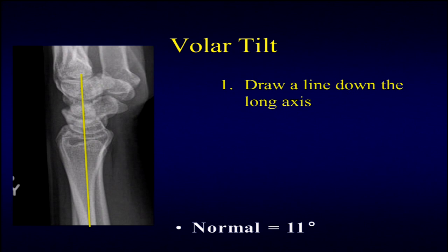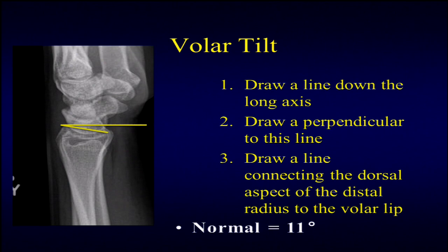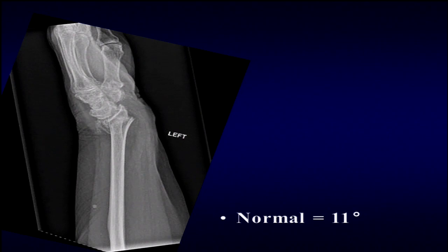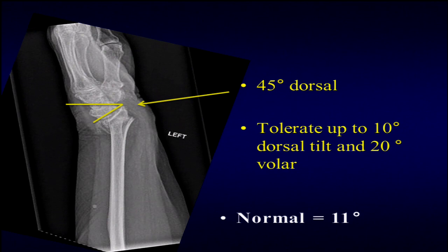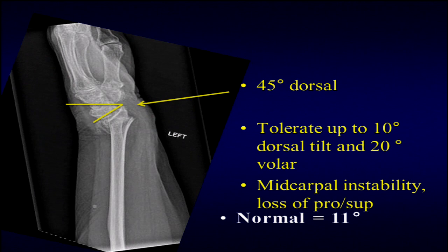For volar tilt, you draw a line down the long axis, a line perpendicular to that, and then measure your volar tilt. In most patients the standard is 11 degrees, though this is hotly debated in terms of how much you can accept. In this patient, drawing those same lines, we see about 45 degrees of dorsal tilt. Common guidelines are about 10 degrees of dorsal tilt and 20 degrees of volar tilt as limits; above those, patients start to develop mid-carpal instability as they break through the mid-carpal joint rather than bending through the wrist.